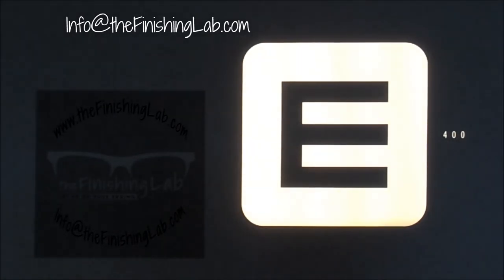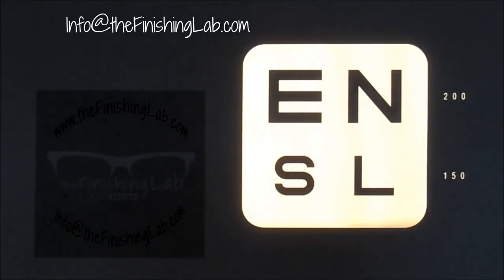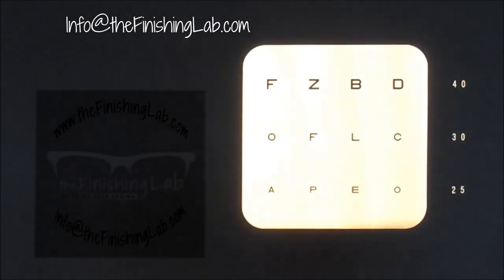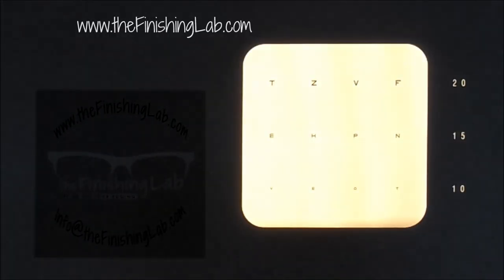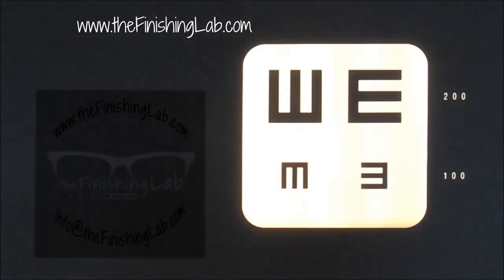This is the finishing lab and we have for sale a Topcon ACP7 chart projector. I just want to go through all the modes to show you that everything works. I'm using the remote, which is included. All the alphabets — this is just being shot onto a piece of paper on the wall, but the definition is very clear.